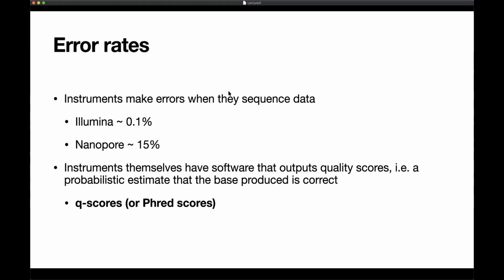And then you also do it by sequencing. You actually do exactly the same sequencing protocol. All the differences are in how you prepare your sample. So you have to tag your DNA in a specific way and digest it and then interpret the reads in a different way. But the instrument that you use is exactly the same, and it just sequences DNA, but you process it differently. So there's a major difference in how accurate the sequencers are.